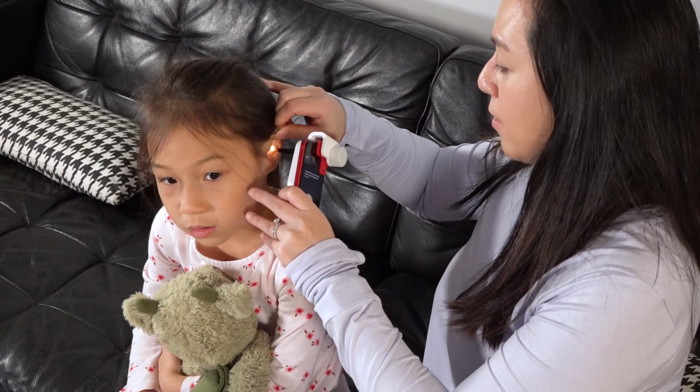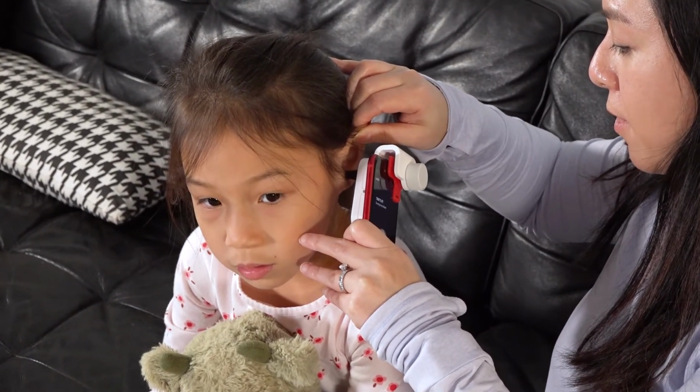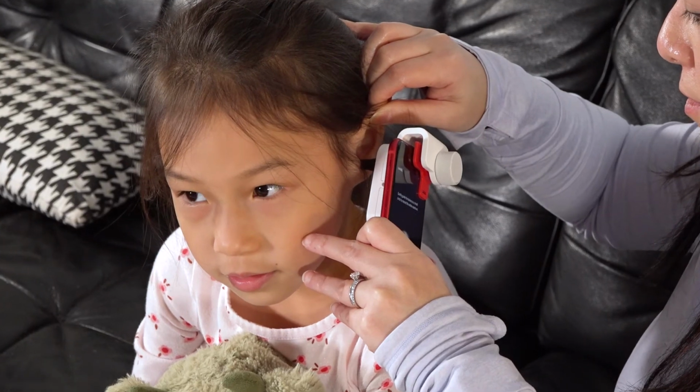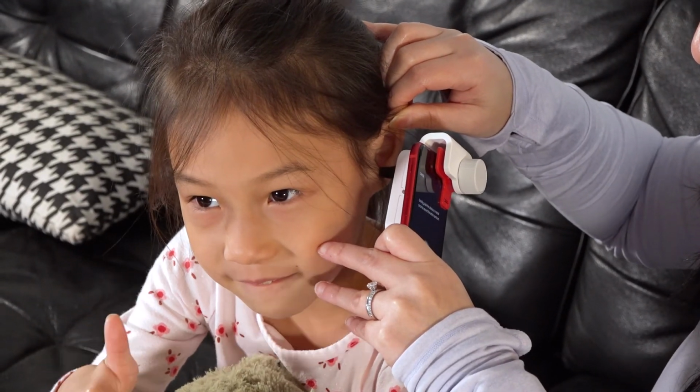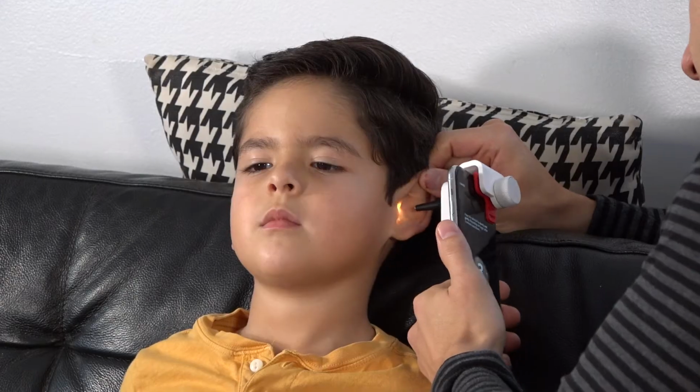Hold the device in the same hand as the ear you're going to record, and steady your hand by resting the backs of your small fingers against your child's face. Slowly and gently guide the specula tip into the ear canal.